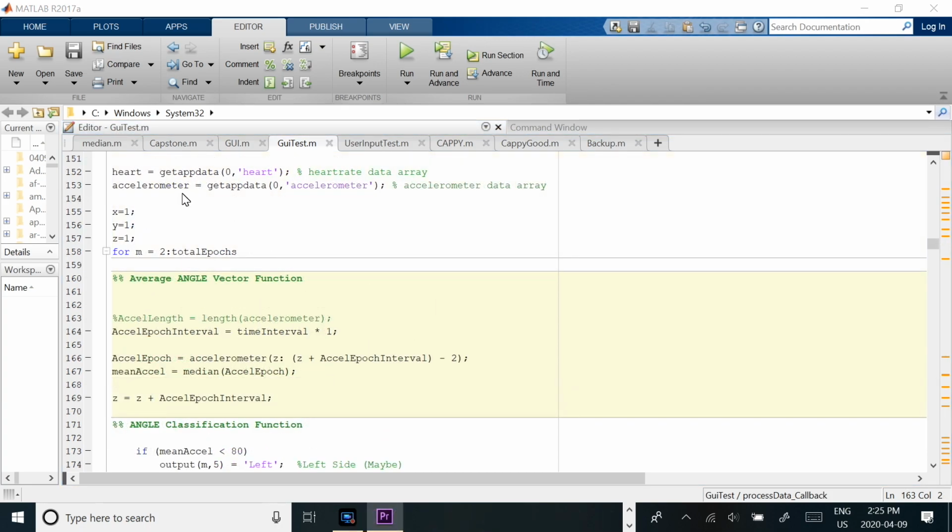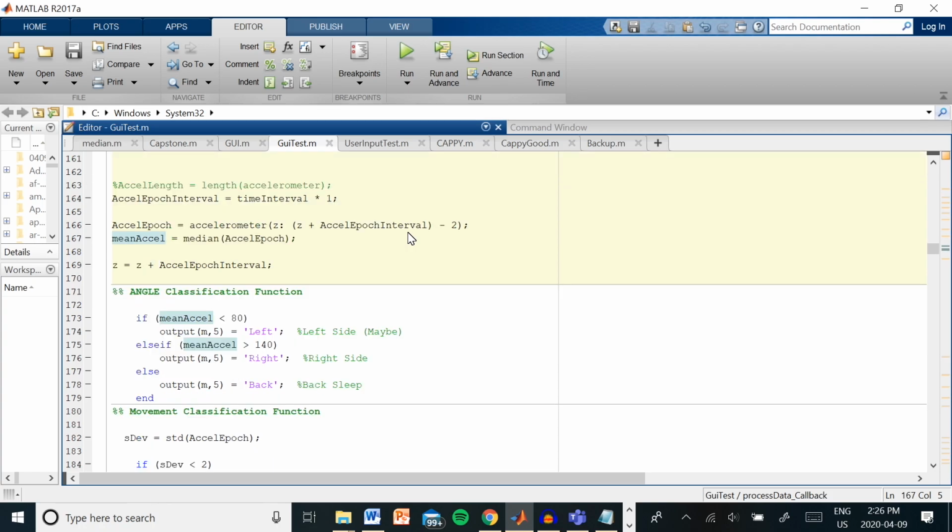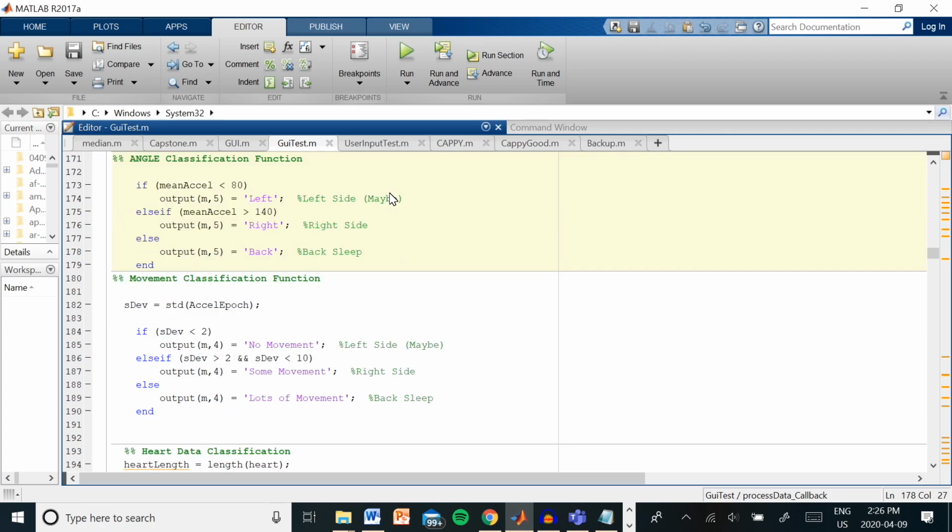In the accelerometer code, it takes the data that was collected in the acquire step and calculates the median angle of all the samples in that epoch. It then classifies each epoch as position left, right, or back. Looking at the same samples, we get the standard deviation in the epoch and classify the user movement as no movement, some movement, or lots of movement.